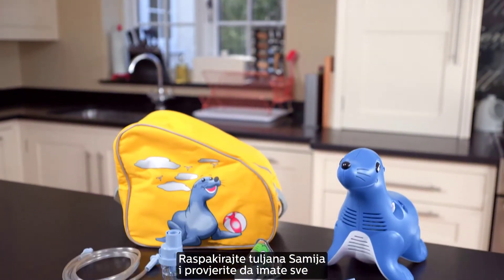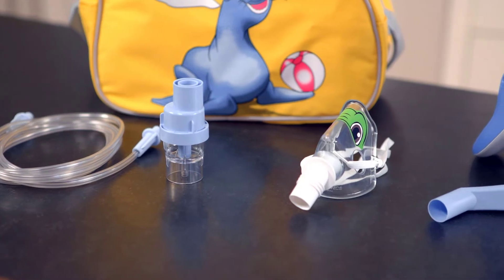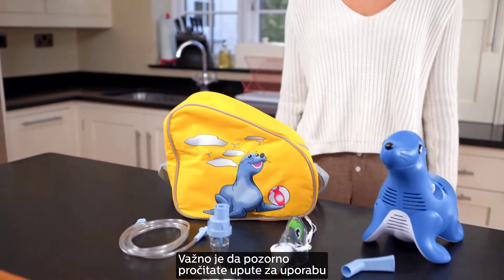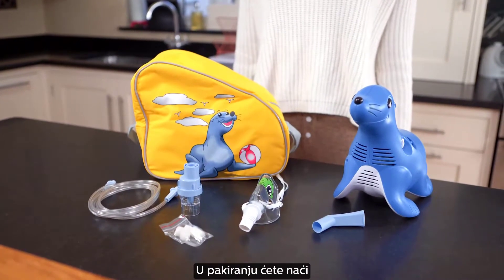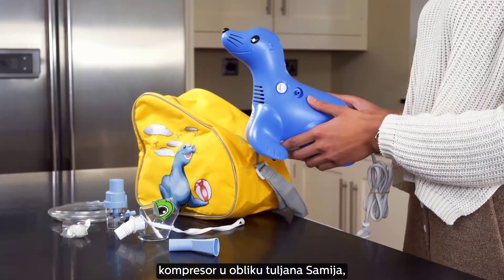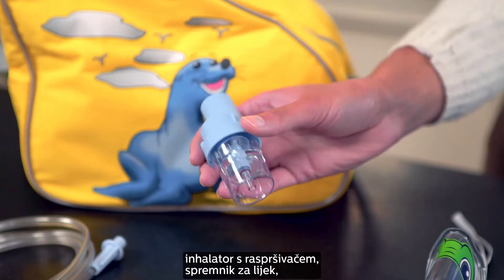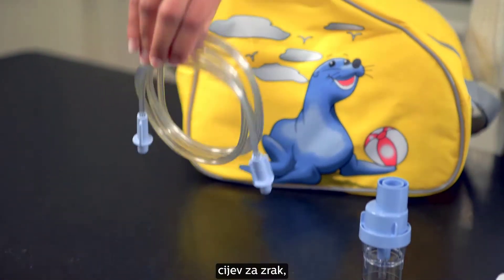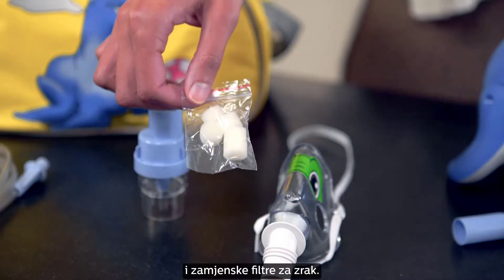Unpack Sammy the Seal and check that you have all of the items listed and that nothing has been damaged. It is important to carefully read the instructions for use before you use Sammy the Seal for the first time. In the box you will find the Sammy the Seal compressor, a carrying case, Sidestream nebulizer, Tucker the Turtle mask, nebulizer tubing, nebulizer mouthpiece, and replacement air filters.